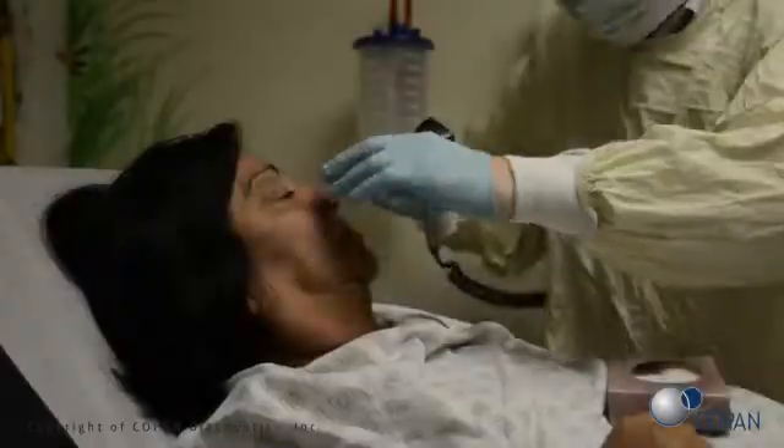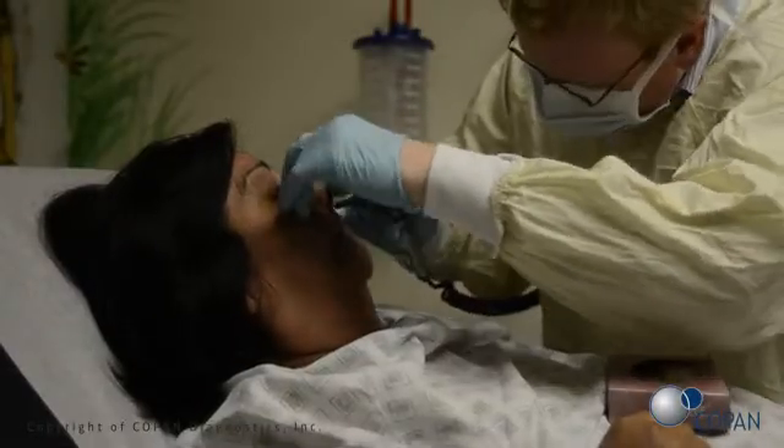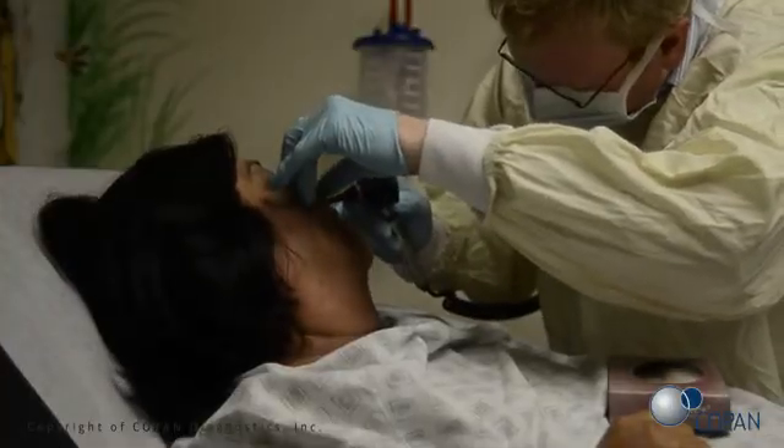Before beginning the procedure, confirm that the patient does not have a deviated septum or any nasal obstruction.